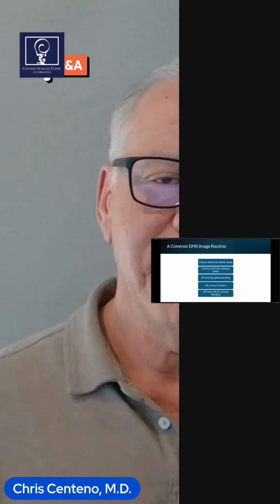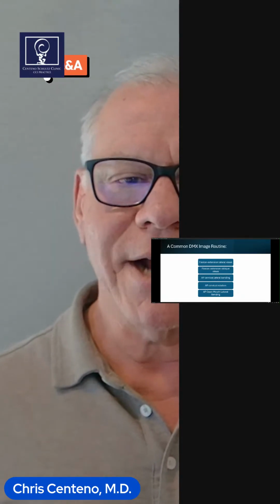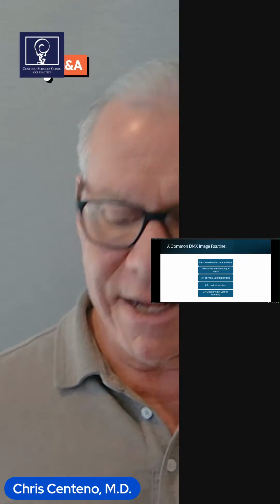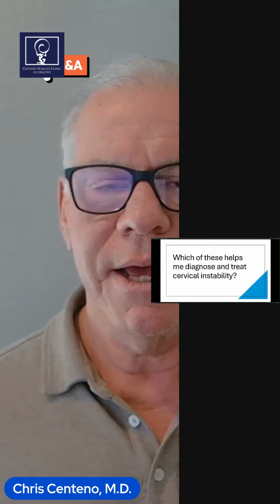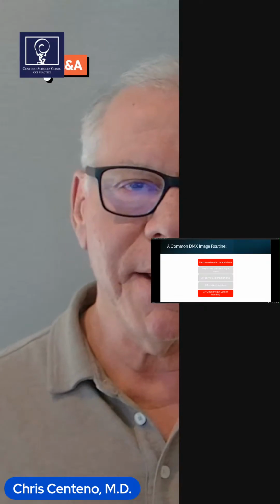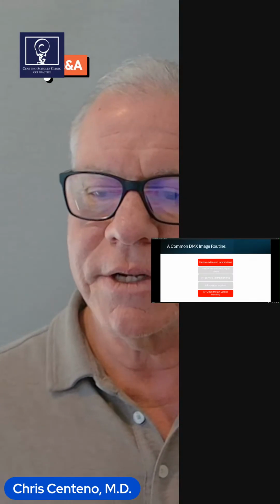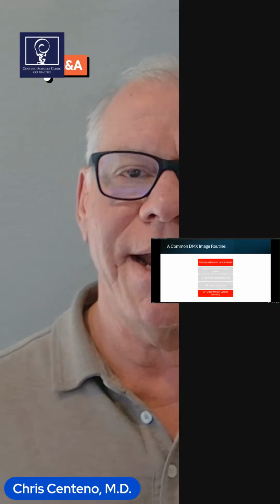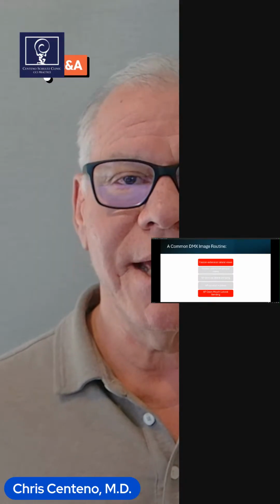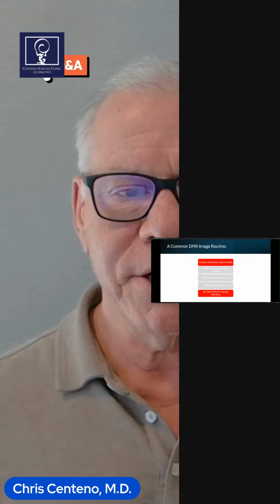Now, of these, there's only 2 that I really look at on a day-to-day basis that are going to provide me actionable information for that patient. So why not just focus on those 2? That would dramatically reduce the radiation exposure. So that's what we've done at CSC. We've gotten rid of the ones in the middle here that aren't providing actionable information to me as the doctor, and we're just focusing on the ones that do provide actionable information. And as a result, obviously, that's less fluoro time. Less fluoro time equals less radiation exposure.